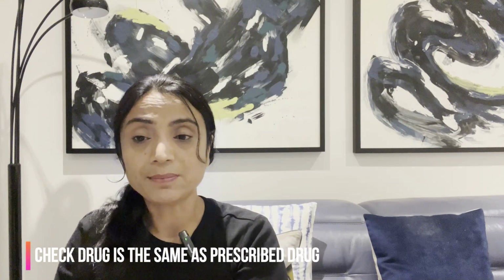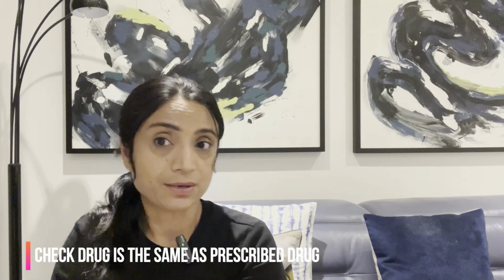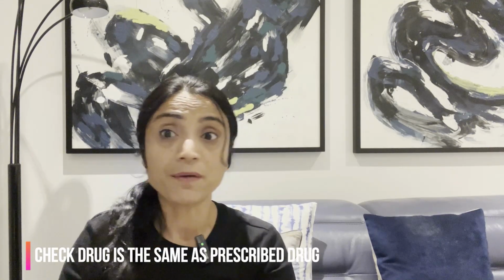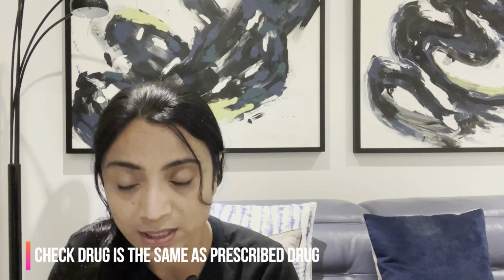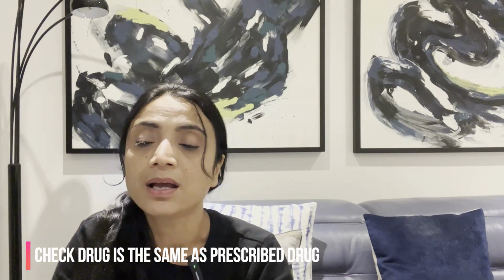Yes, this is salbutamol. Yes, in my prescription this is salbutamol, 100 microgram. Yes, it's the same as in my prescription, and I will be giving 1 puff or 2 puffs as prescribed, and I can check that this is the same drug as my prescribed drug. So that's really, really important, and I can't tell you how many people fail on that, not checking your drug against your prescription.